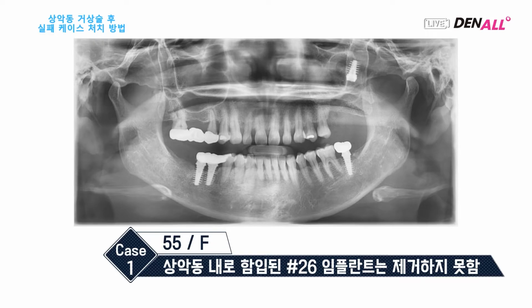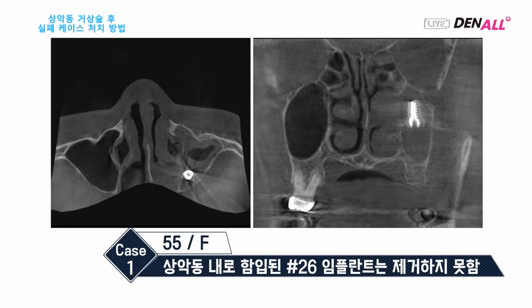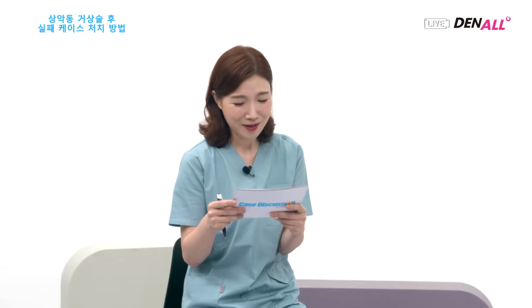This is the CT X-ray. So the fixture has migrated deep into the sinus. How can we plan the treatment? It is a very frustrating case. Dr. Jeong, what do you think? It is really regrettable.